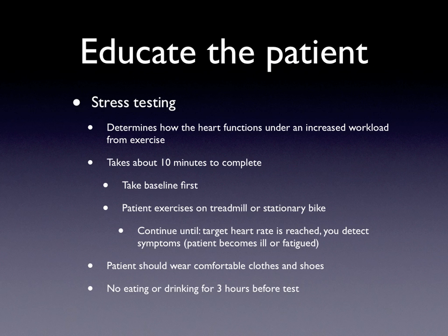I've told you before that I've had a stress test myself, and the target heart rate for my stress test was 138 beats a minute. So when I reached 138, that's when they backed it down. The patient should come into the office or wherever the site of the stress test is going to be wearing comfortable clothing and shoes. Obviously, if they're going to be walking on a treadmill or on a stationary bike, we want them to have shoes on.